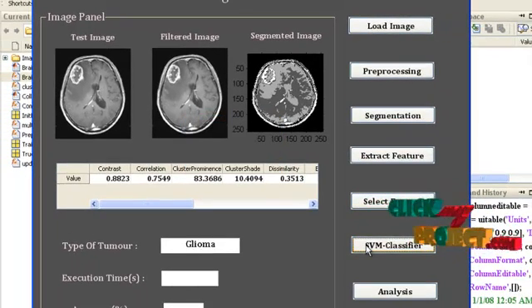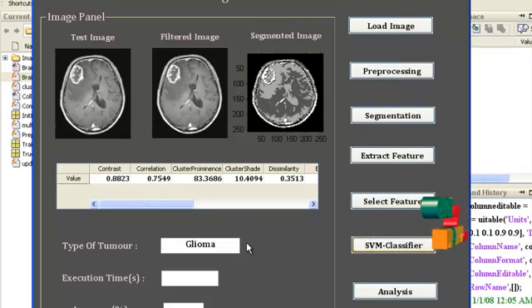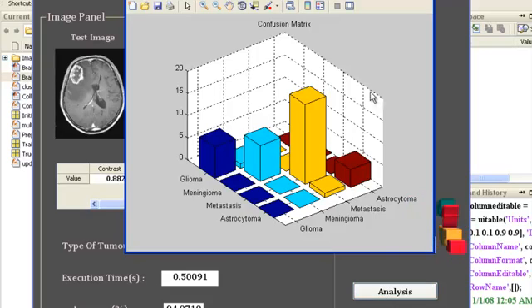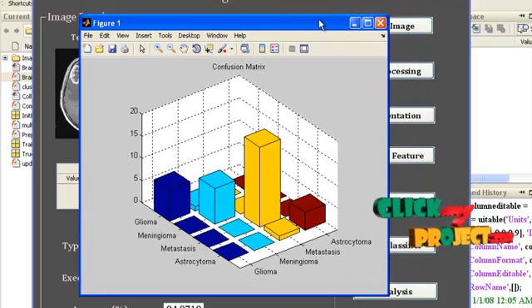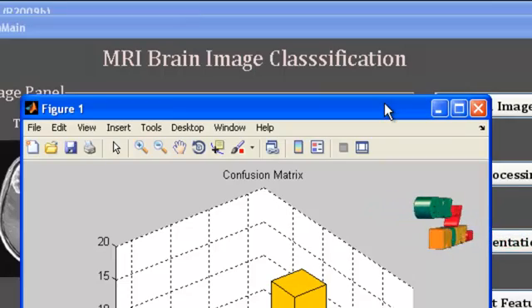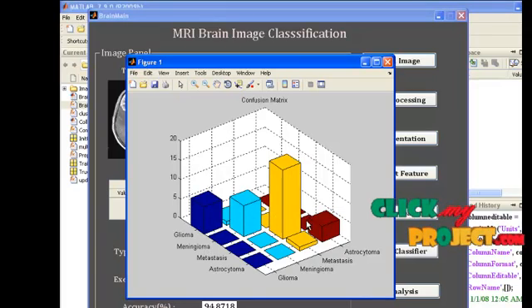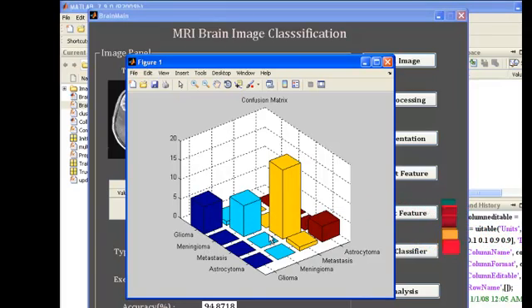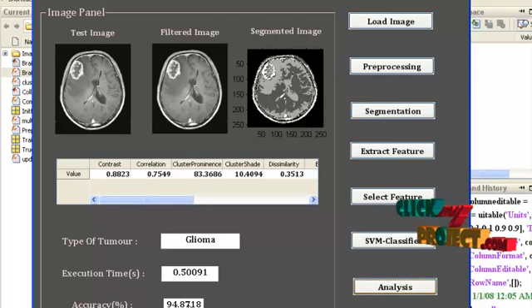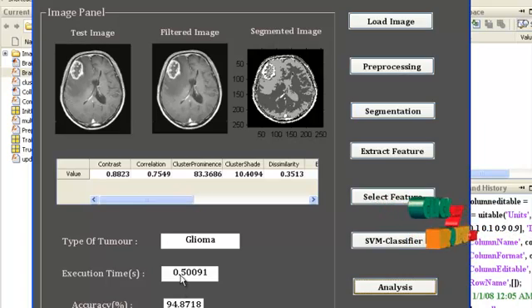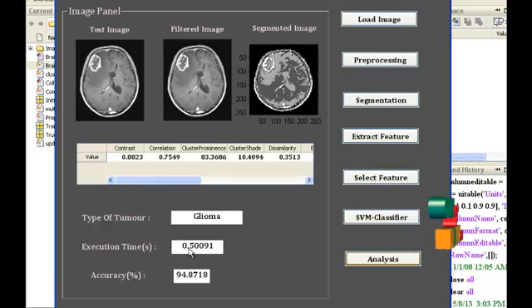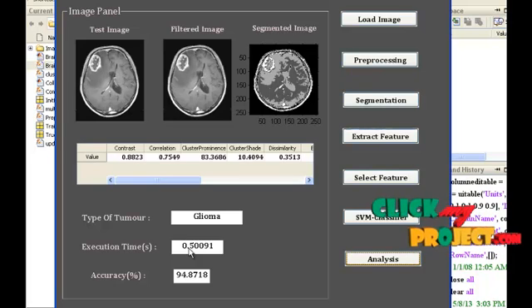Next, press the button SVM classifier. It will predict the tumor type as glioma, and the result is displayed in the text box. Now press the button analysis. The execution time and accuracy will be computed. See this confusion matrix for each tumor type category — the corresponding correct and misclassifications are denoted here. The diagonal elements show the correct classifications; all off-diagonal elements are considered misclassifications. We are able to obtain an accuracy of 94.87% within a short duration of time. The execution time for the prediction of a tumor type for the given test image is 0.5 seconds. We can confirm our system gives the best performance for the prediction of MRI brain tumor. Thank you.